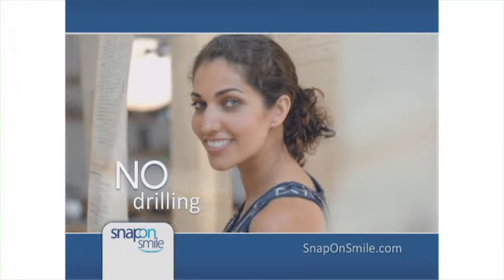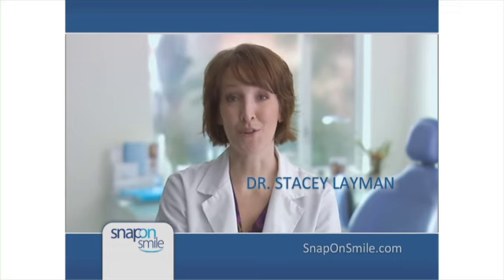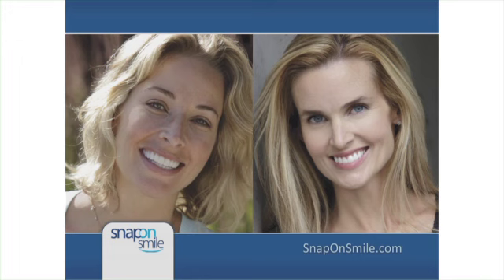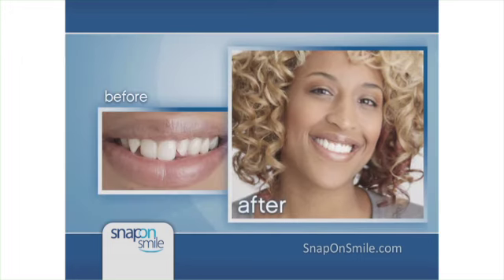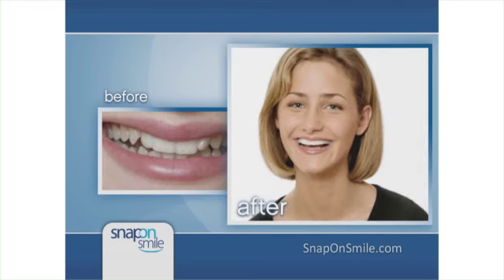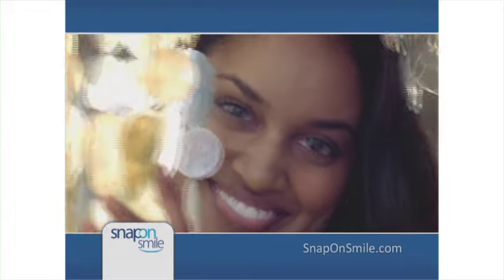There's no grinding, no drilling, no shots, and no pain. Snap-On Smile can be fitted in two visits. It's easy, painless, and beautiful. Both these ladies had smile makeovers — one cost almost $10,000, the other has a Snap-On Smile. Can you tell which is which? Then why pay thousands? I got my Snap-On Smile more than two years ago and I wear it every day. I've had Snap-On Smile for four years and it still looks beautiful. Snap-On's great for special occasions like weddings, job interviews, or vacations.